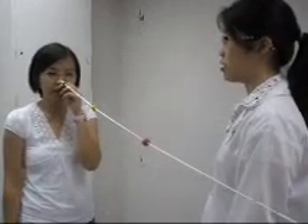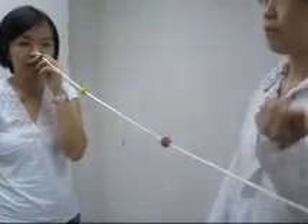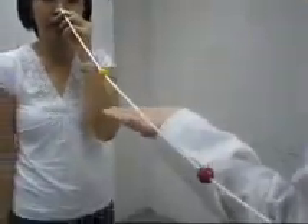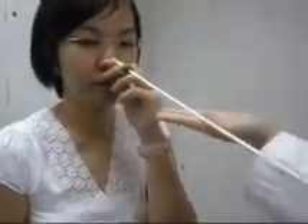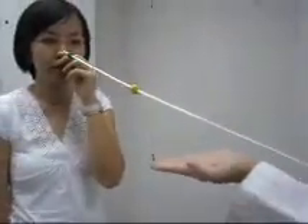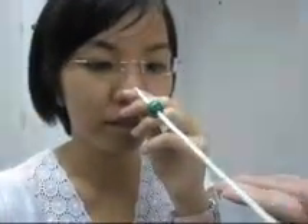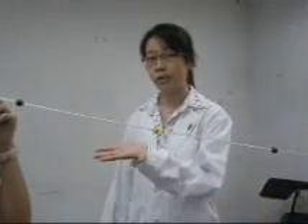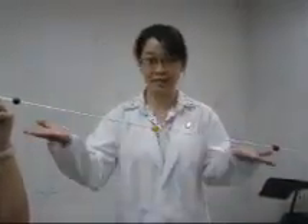Now I'm going to train your convergence. Please look at the red bead, and the yellow bead, and the green bead. Please look at the red bead, and the yellow bead, and the green bead. This cycle is repeated several times to improve her convergence at this distance.